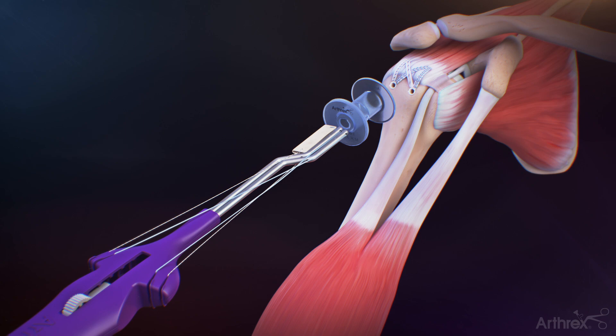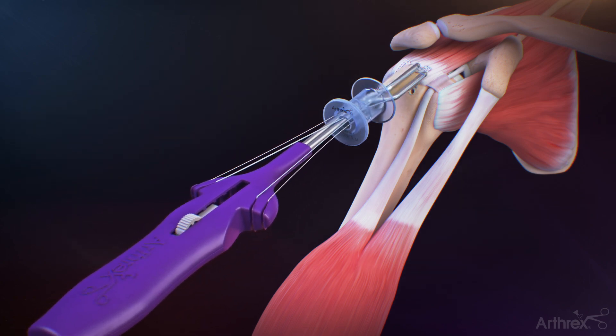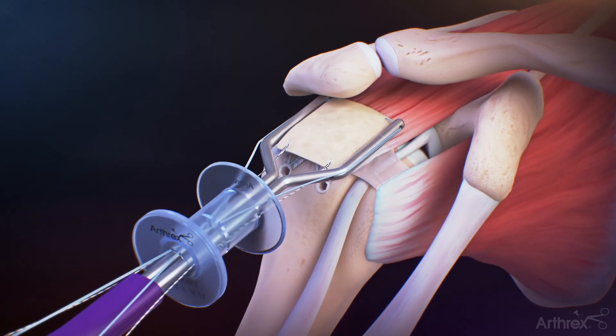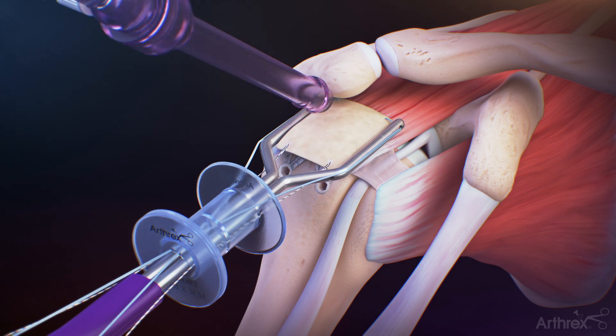Once the tips of the graft spreader arms enter the subacromial space with sufficient clearance, deploy the graft spreader by sliding the button forward to fully deploy the graft. Introduce the tissue tack tendon anchor inserter through a 5.75 mm cannula located in the superior lateral portal just off the lateral edge of the acromion.